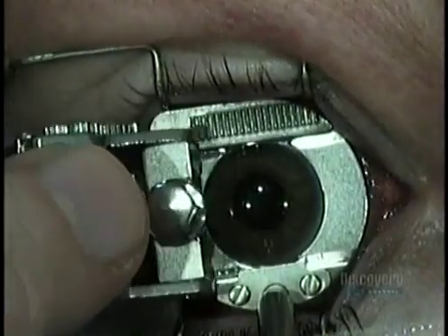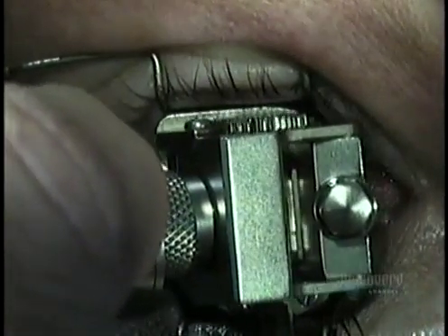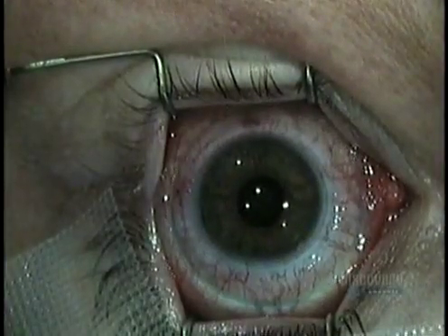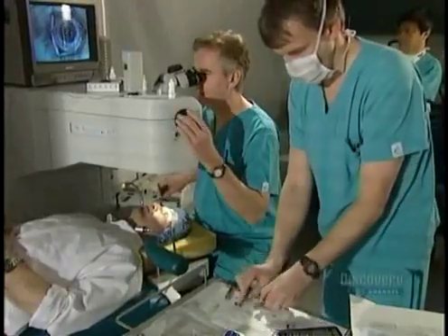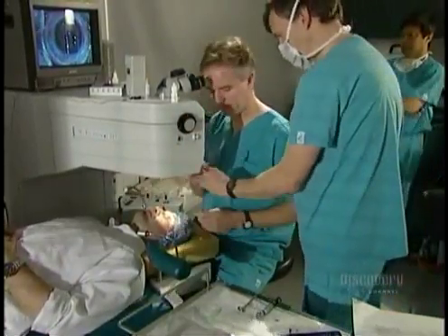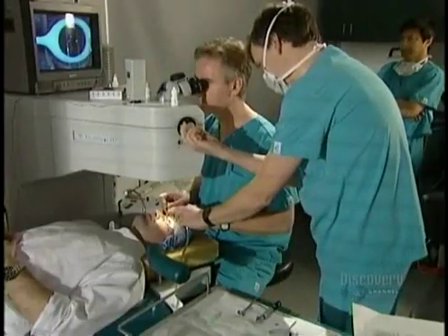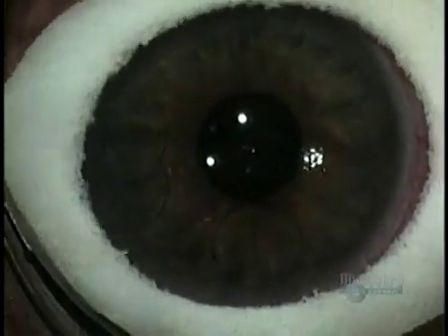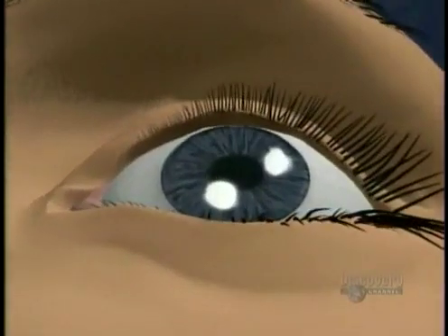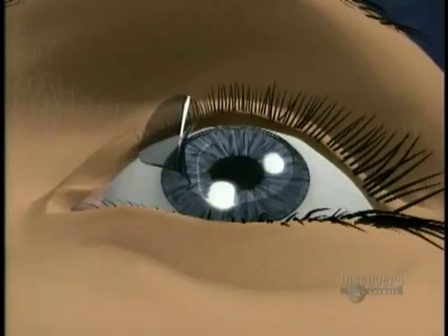He takes the microkeratome and slips it into grooves in the metal suction ring. In a matter of seconds, the device moves across the eye, cutting open a flap of tissue, the same way a carpenter's plane shaves a layer of wood. The surgeon uses a sterile sponge ring to keep tears from contaminating the cornea. He folds back the flap of tissue, exposing the cornea.